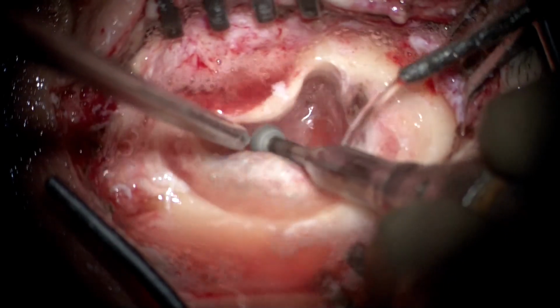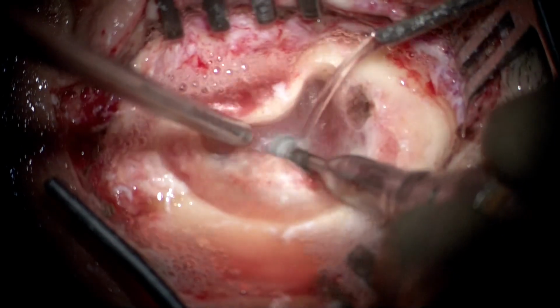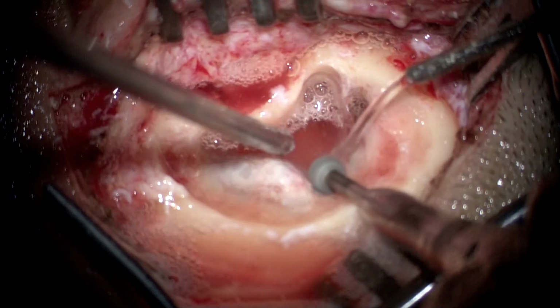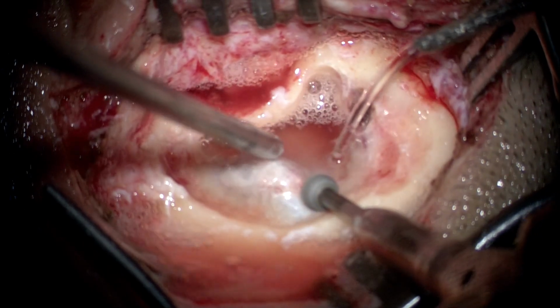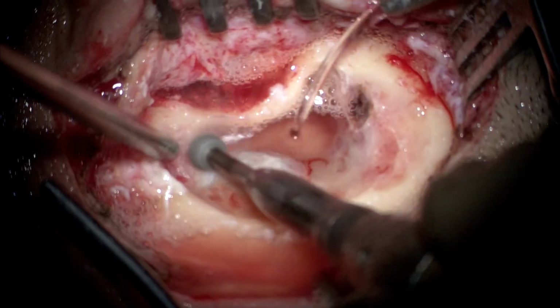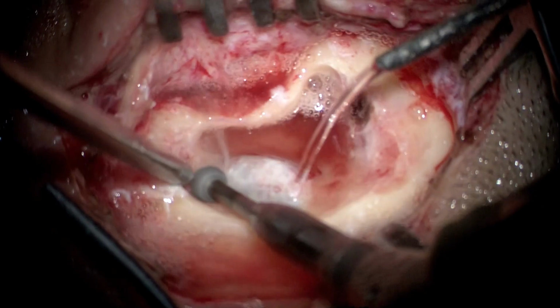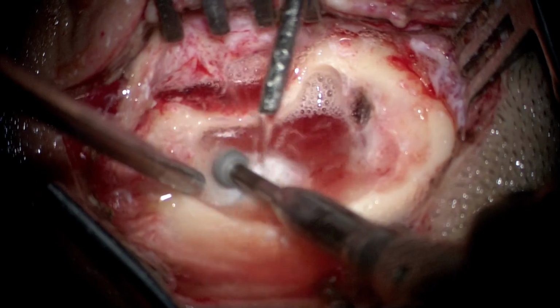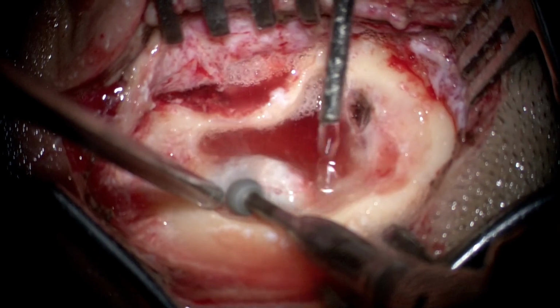We can see here that we have increased the amount of irrigation that we are using, and we do not intend to stop drilling, because then that wastes a substantial amount of time. We continue drilling, and some bit of ooze or bleeding can be managed with profuse suction irrigation.